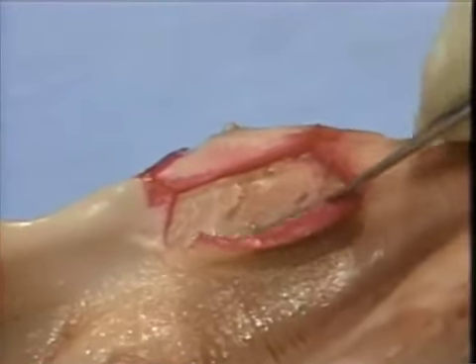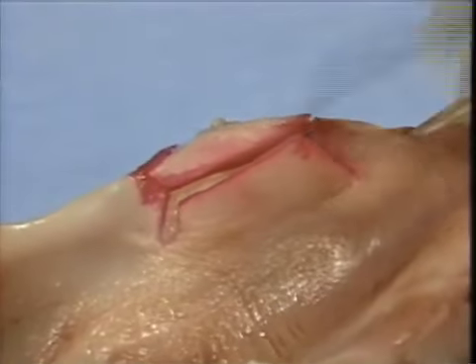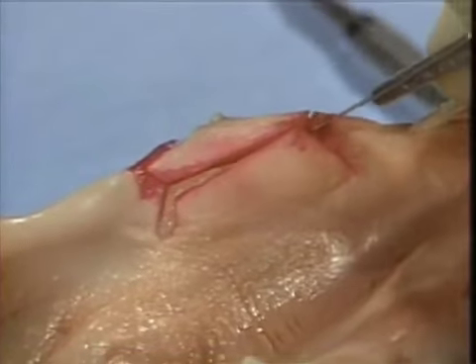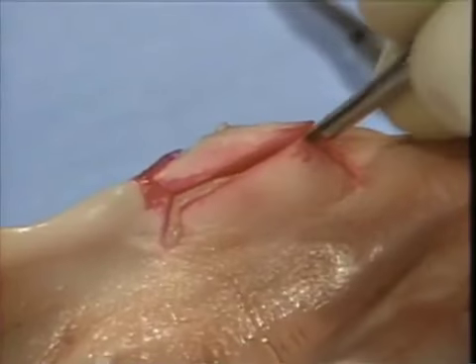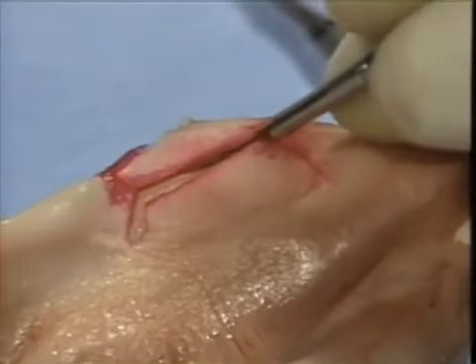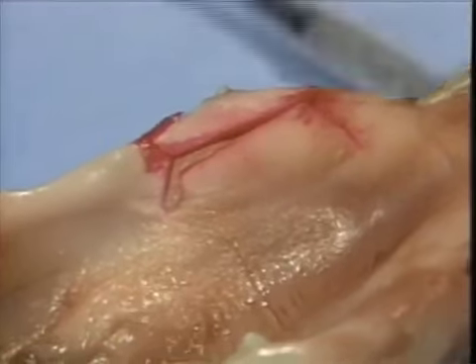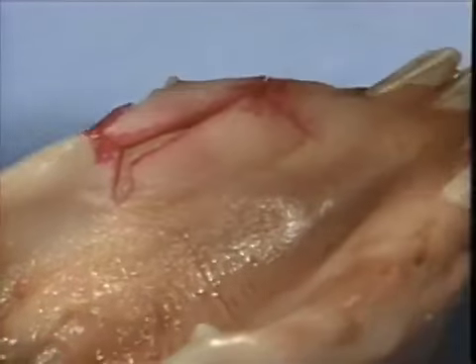And here we can see elevation of a full thickness flap on the lingual portion of this mandible. We would like to emphasize the use of scalpels to begin the elevation process. Sharp dissection offers the most atraumatic and controlled method to elevate a flap.